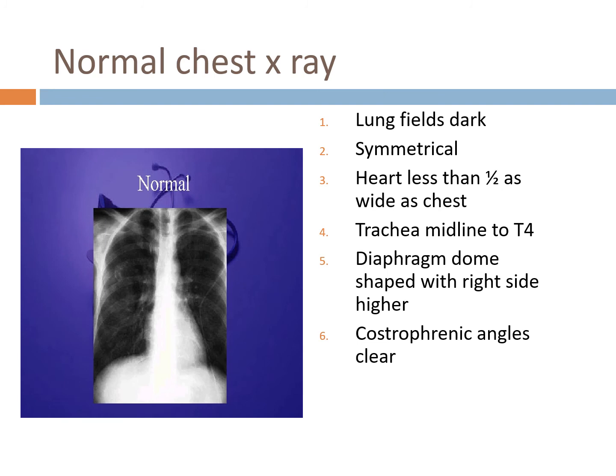So on your MRE2, if there is an increased cardiothoracic ratio, it is a sign of what? Okay, so if you have an increased cardiothoracic ratio on your chest X-ray, so your heart looks bigger than it should, you should pick the answer, or write the answer of CHF, congestive heart failure.